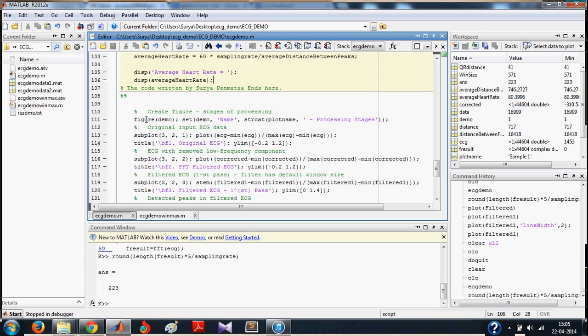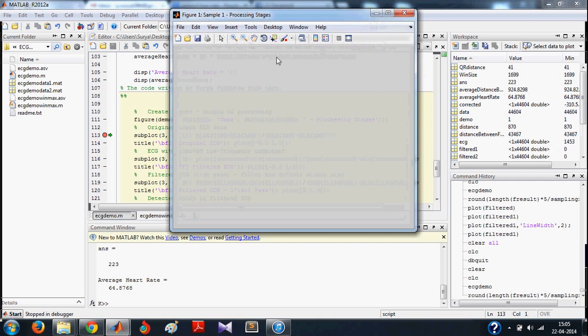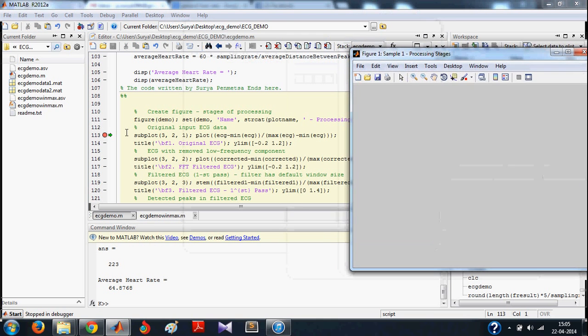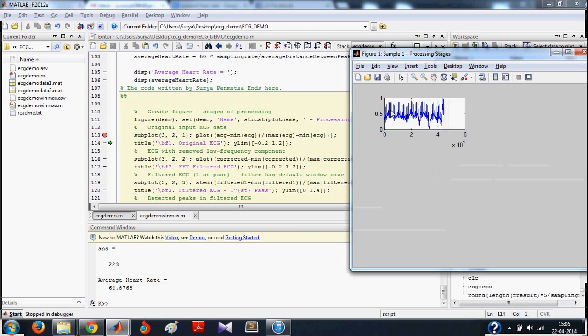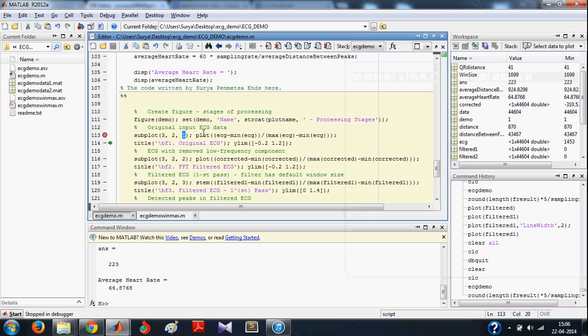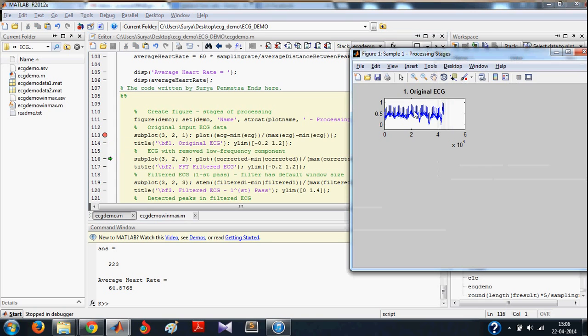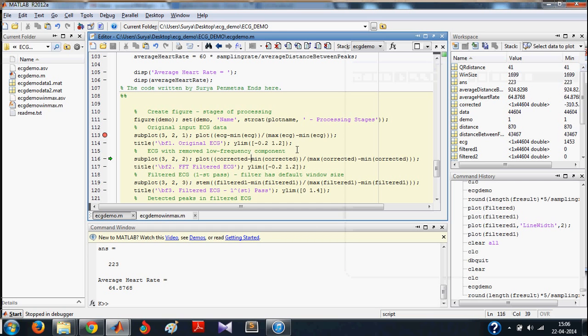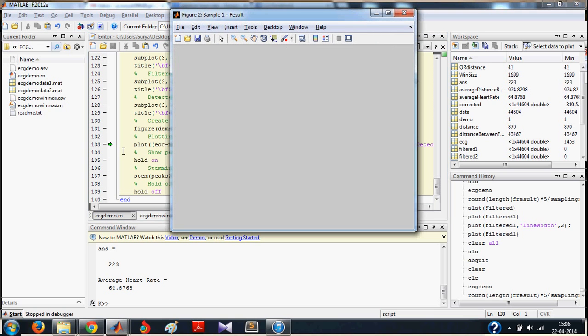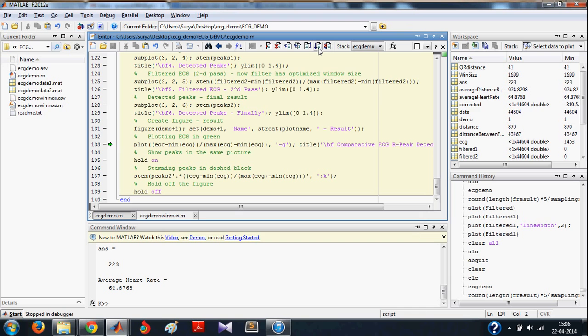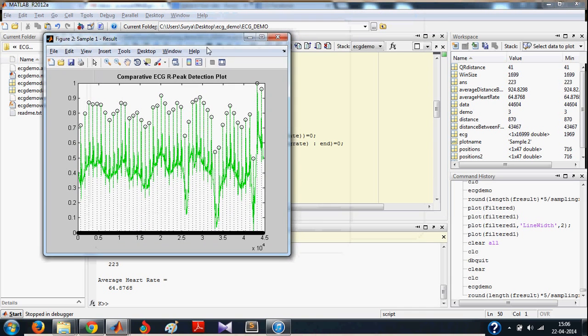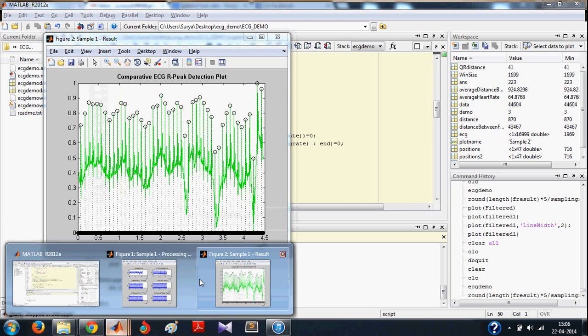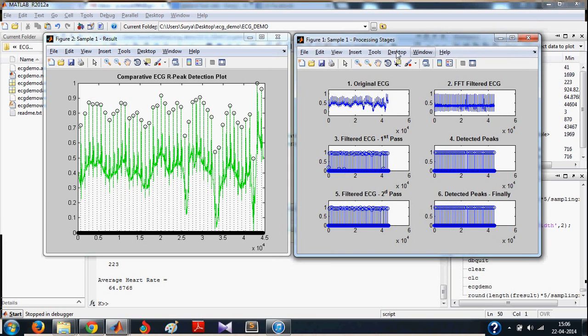Later, you display all other signals. You use figure to get a new window. You use subplot 3, 2 to get a 3 by 2 matrix on your figure. Let me show this to you. You get a figure now. When you do subplot, your screen is divided into 3 by 2 parts: 3 vertically and 2 horizontally. This takes the first position. And then you give it a title and y-axis limits. You can see the title coming up here. Similarly, you plot all the other signals that we have worked with.